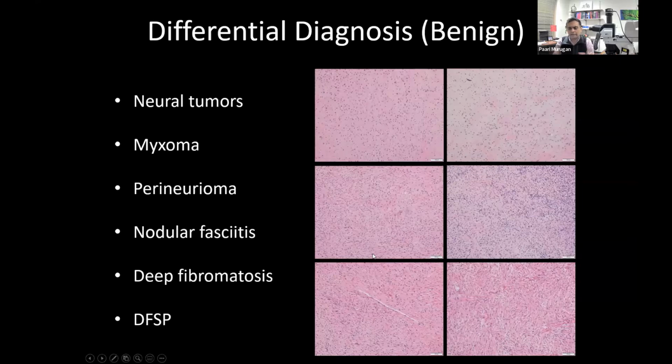I like this exercise because every time I look at these soft tissue tumors, I know most of them are very heterogeneous. I always keep thinking in my mind, what if the surgeon biopsies from this area? How would I make the diagnosis? What would my differentials be? So going through this exercise is very useful from my perspective, and I wanted to share it with you.